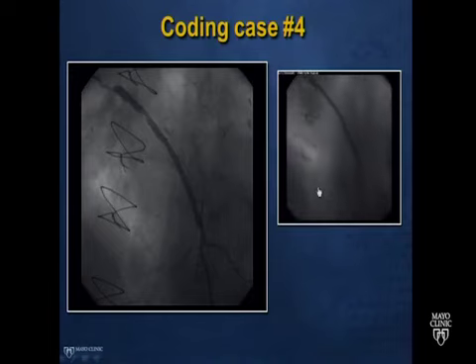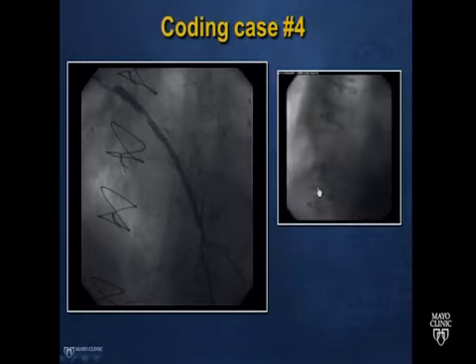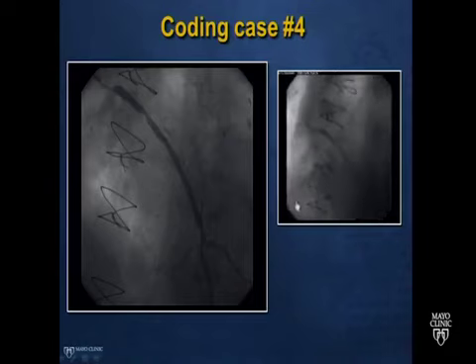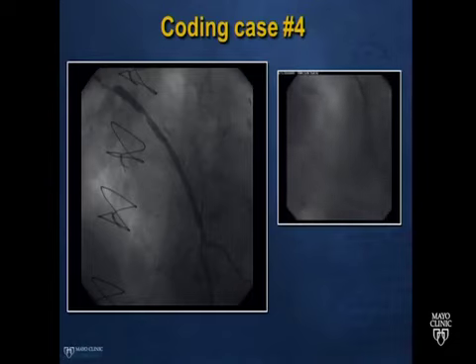And I don't know if you would need to code disease in the right coronary artery, presuming it's severe disease because these collaterals are present. I certainly don't think you would be dinged for it either way. It would be reasonable to put something down, but we're not showing you the right coronary artery per se. But you can presume that the right has severe disease.